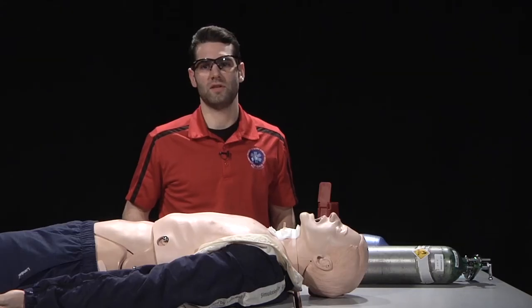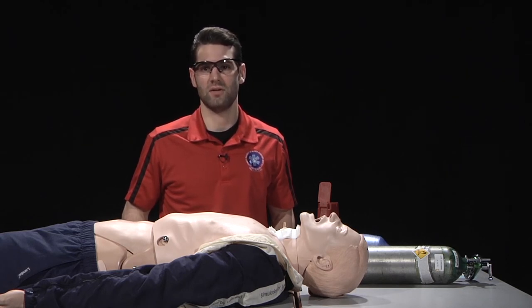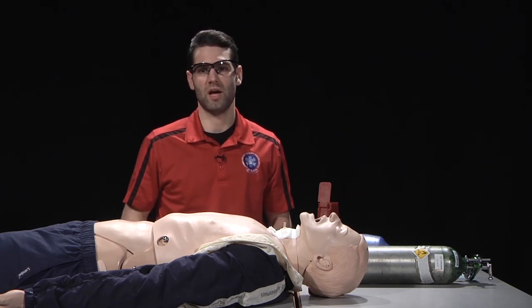Once the device has been secured, I would observe the patient for chest rise and auscultate lung sounds to assure adequacy of ventilation. I would then continue to ventilate the patient and observe for possible complications such as subcutaneous emphysema, hemorrhage, hypoventilation, equipment failure, catheter kink, or false placement.